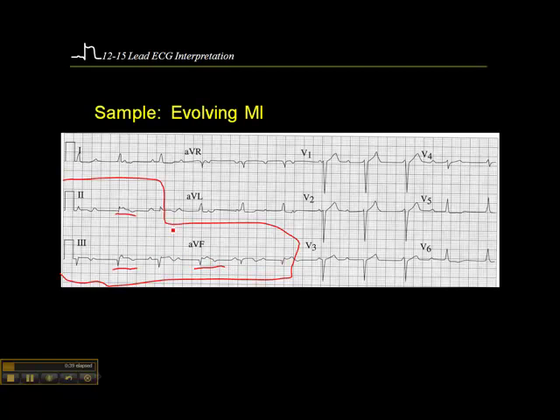So here we have signs of necrosis, of injury, and ischemia. And this means that, because we have evidence of necrosis, this is an MI that's been going on for some time. We don't know how long, probably less than 24 hours. But it's an evolving MI, meaning that it's got all three components.